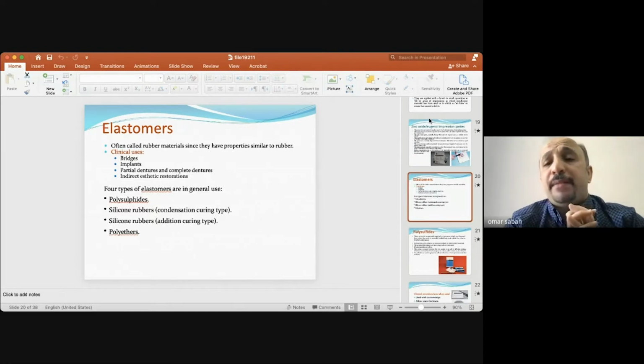If you have any damage to these impressions, or any bubbles, for example because of thick saliva, you can cover these bubbles or depressions with wax.